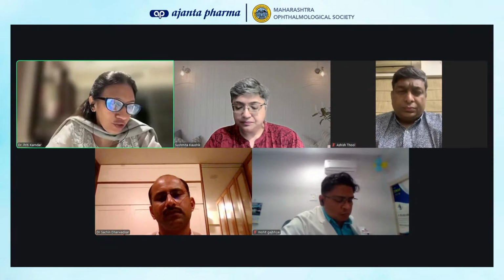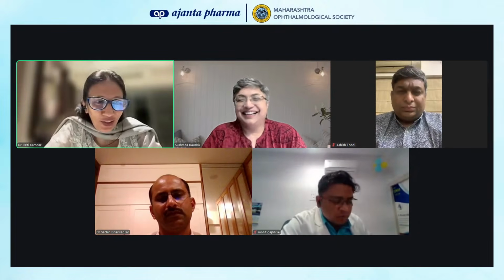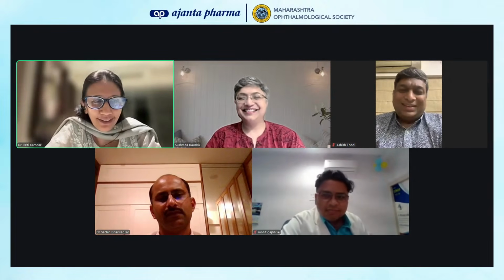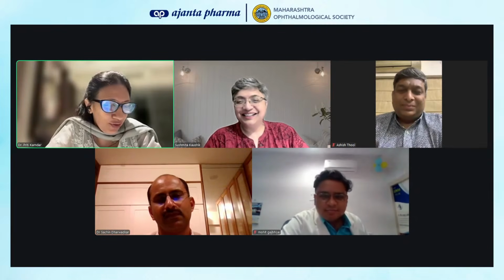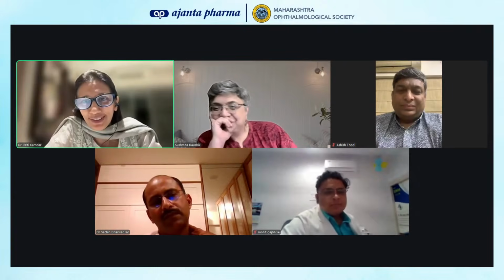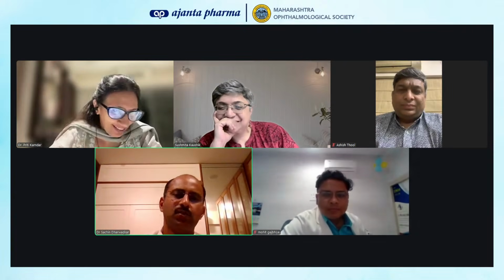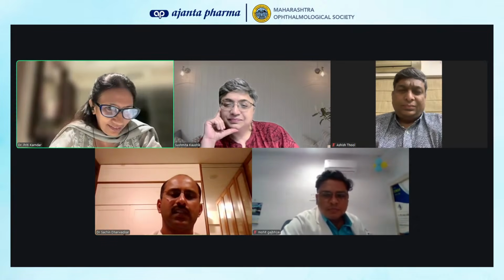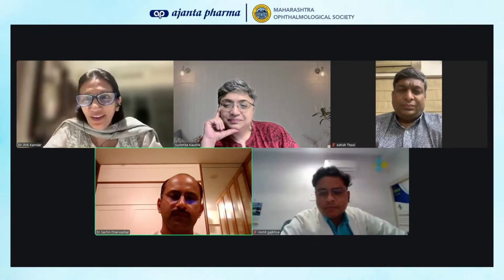Now, which OCT machine is most accurate? You have already said that, but we want the names. So Dr. Sachin, which according to you, Dr. Ashish and Dr. Sushmita? No financial interest. Technically, absolutely, the most superior is Spectralis. Second comes closest, Cirrus 6000. All right. And you would not use any other machine? No.